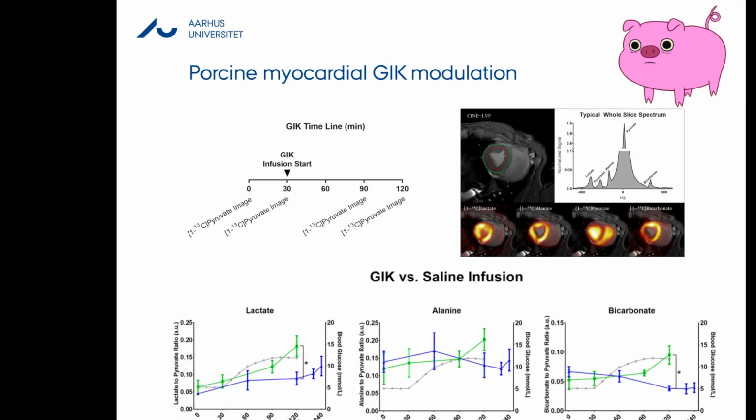that it goes up, but the variability isn't much different from a pig that has been scanned over similarly many hours, but there is an increase after 2 hours. You can start to get this higher ratio.